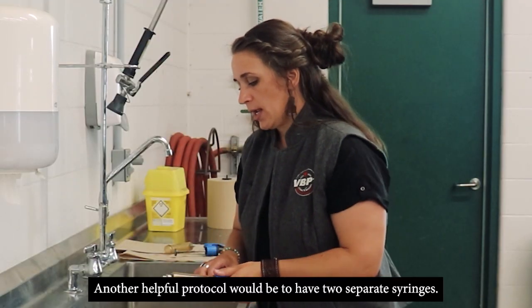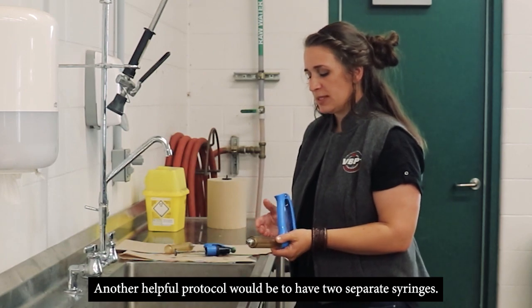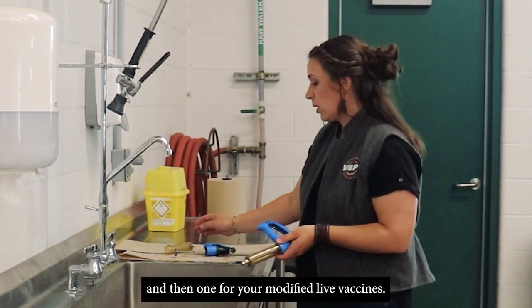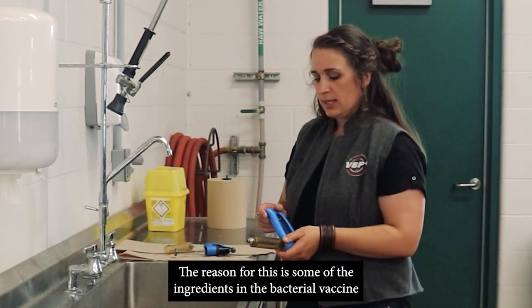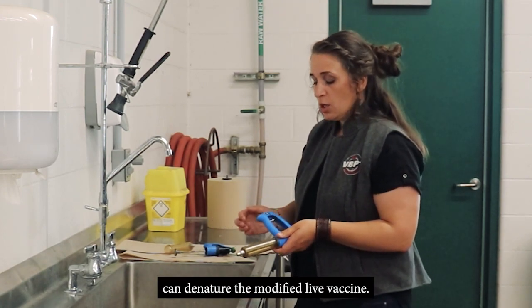Another part of the protocol would be to have two separate syringes — one for your bacterial vaccines, and then one for your modified live vaccines. The reason for this is that some of the ingredients in the bacterial vaccines can denature the modified live vaccine.